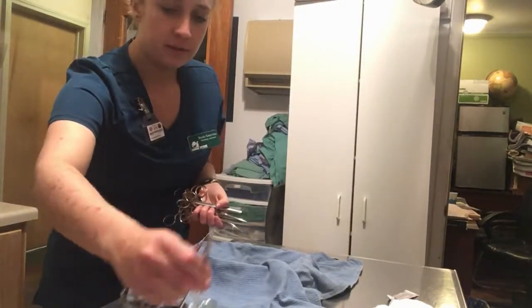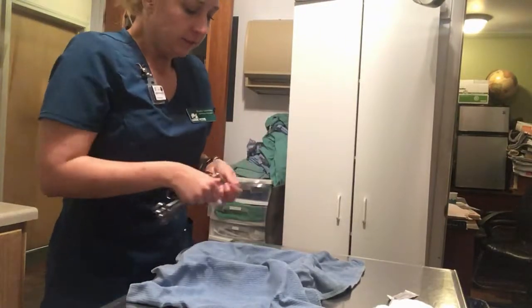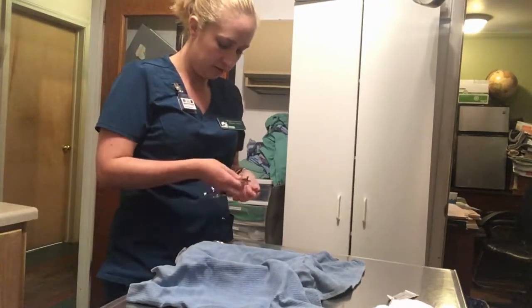I'm going to do the largest first, working my way down.